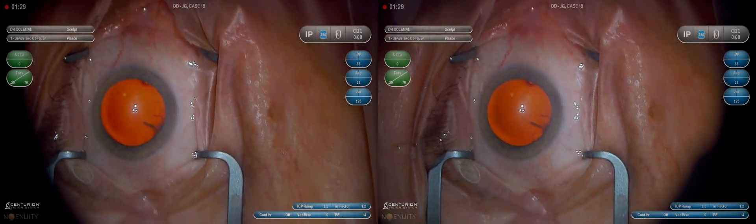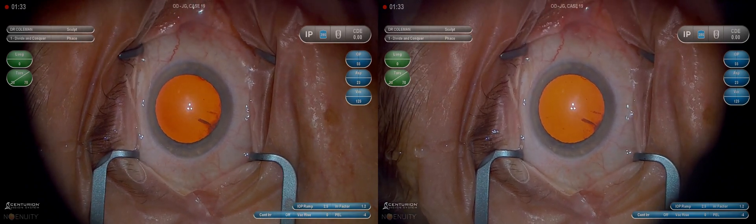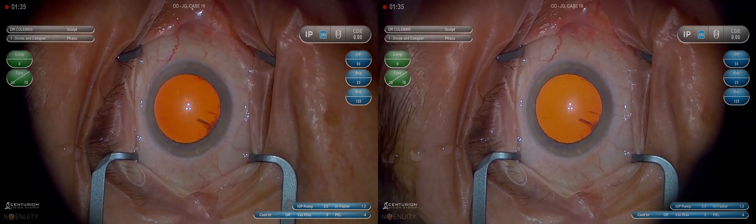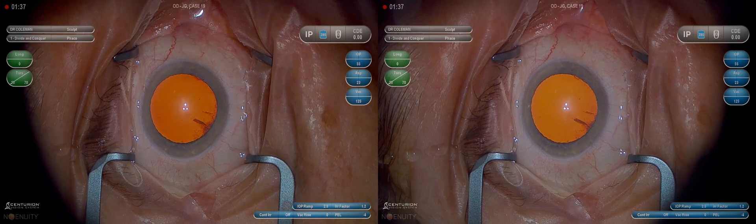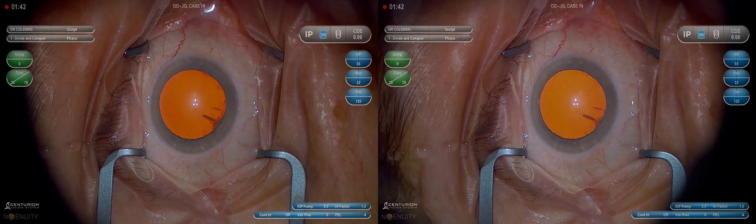This is Dr. Weich Coleman. This video is intended to be a cataract fundamental video. There are many videos on the web that show advanced techniques, but this one is directed specifically for residents and fellows who are perfecting their technique and need to get down the basics. So it's unedited.